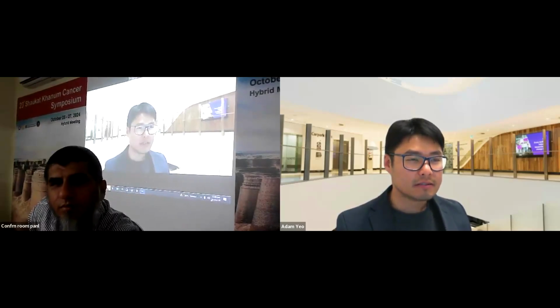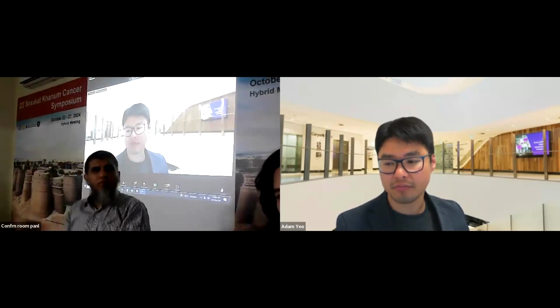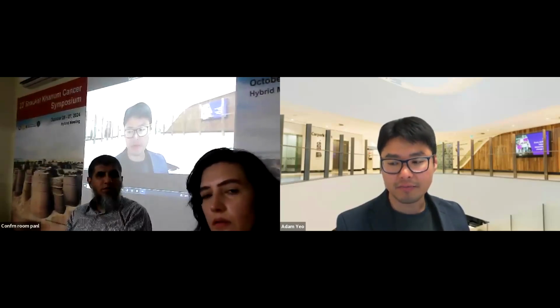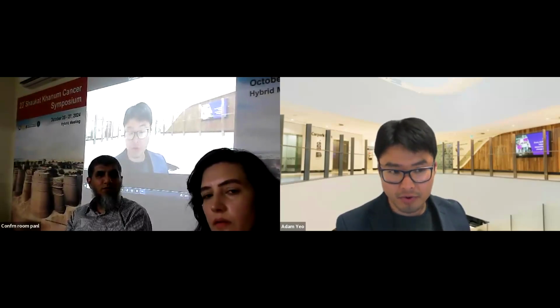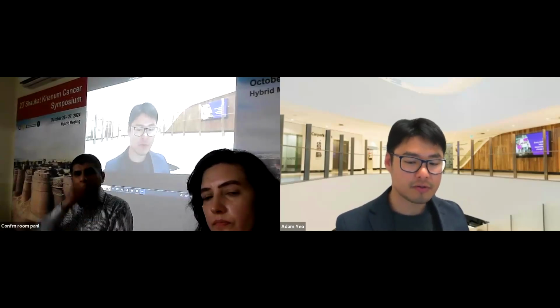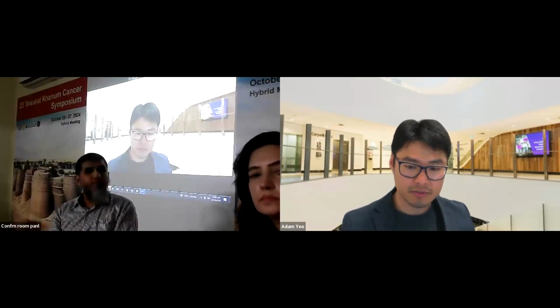Yeah. So regarding motion management, typically most centers in a lot of countries around the globe use 1 centimeter as a tolerance. It's not a hard rule. Anything greater than 1 centimeter, we start considering motion management, and anything less than 1 centimeter, we may not. It's not really an absolute rule because it's all around an isotoxic approach, which means we try to meet the constraints to the surrounding organs at risk, and then we try to boost as much as possible. This isotoxic approach is a principle in stereo.